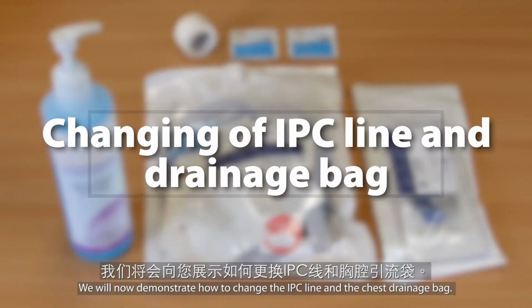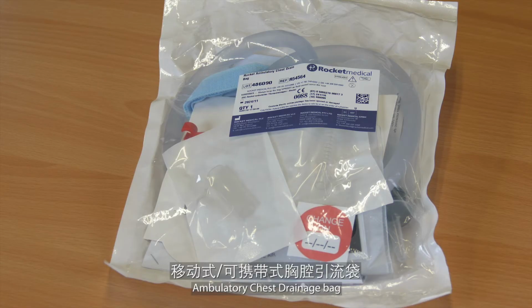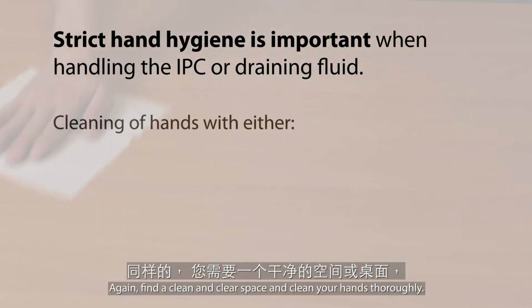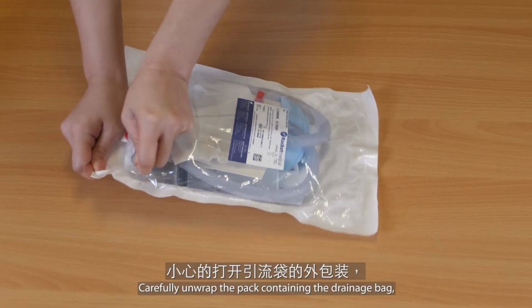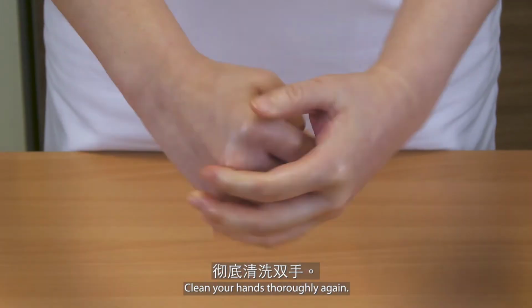We will now demonstrate how to change the IPC line and the chest drainage bag. This should be done every 2 weeks or when the bag is soiled. You will need IPC drainage line or IPC line, ambulatory chest drainage bag, alcohol swabs, surgical tape, alcohol-based hand sanitizer. Again, find a clean and clear space and clean your hands thoroughly. Carefully unwrap the pack containing the drainage bag, taking care not to touch the contents inside. Clean your hands thoroughly again.